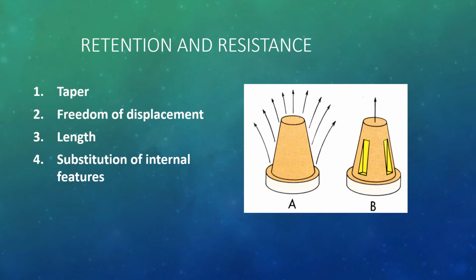In certain cases where there are molars, when you are preparing molar teeth, sometimes they might be submerged, or the occlusal cervical length might be very less in certain molars. So typically when you are examining the tooth itself, you see that the height of the tooth is very less.